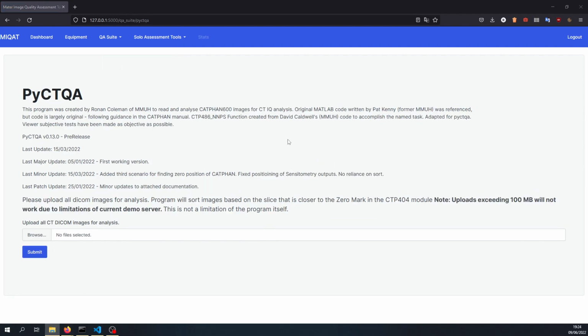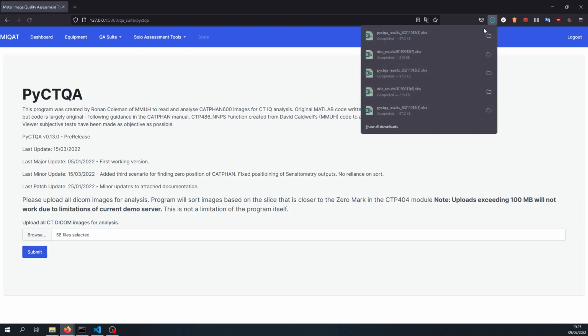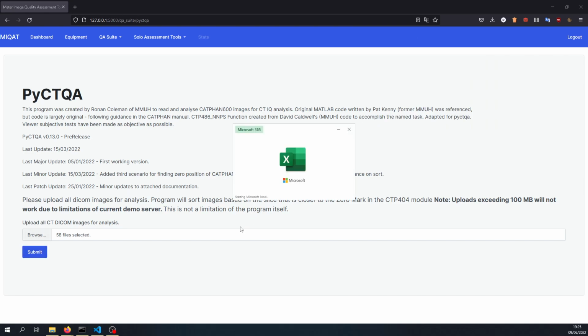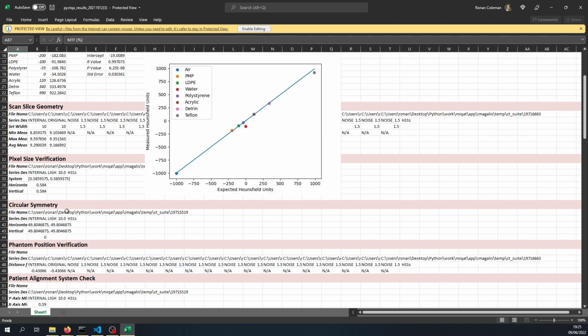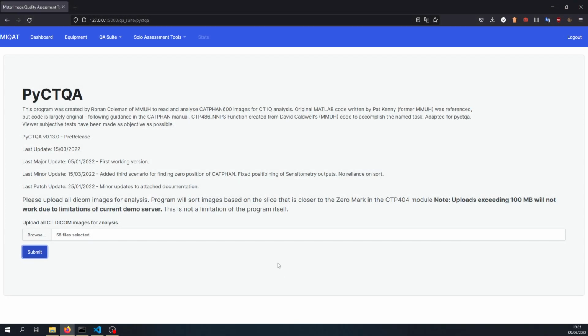Okay, perfect. So let's also try CTQA. Now, if you're scanning through the CATPHAN 600 like we were, there's considerably more than 7 images, but that is not an issue for the program at all. So we'll send it the 58 images, and it'll do its background logic and figure out what slice or what part of the CATPHAN is for which test. So we just have to wait a little bit. And here we go, it's completed. Fantastic. We have our results for some of our tests and sensitometry and all the rest.